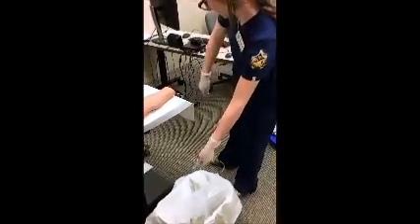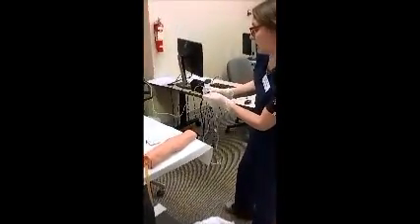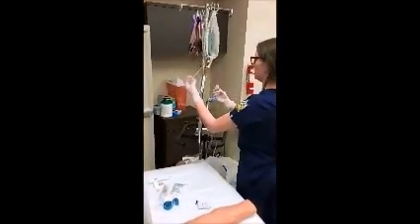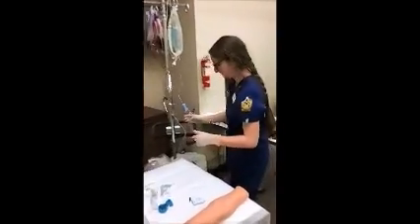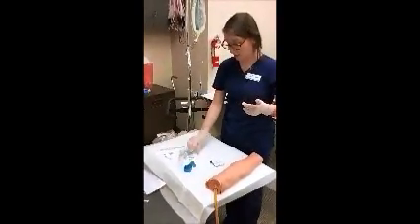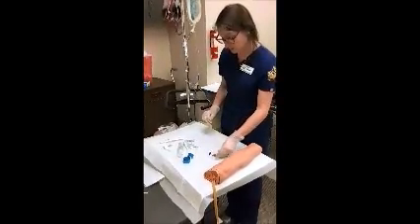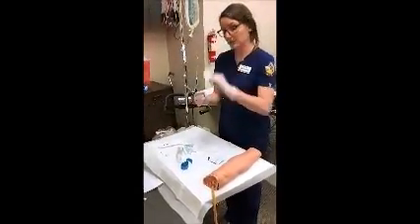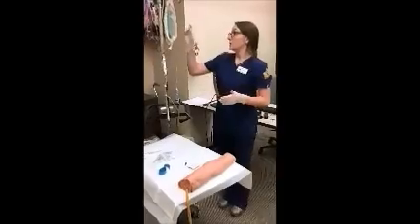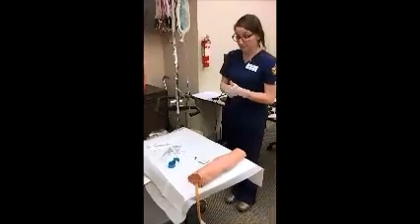You can see there's fluid dripping out of there. We will go ahead and close the roller clamp, and as a double safety, clamp that. Hang this up here and make sure to maintain sterility on that. We'll leave that cap on, that'll help remain sterile. And then we will gather the rest of our supplies: a flush, a catheter, an IV site Tegaderm, some alcohol swabs, tourniquet, and saline lock. And we'll go ahead and transfer all this to the room, including the IV pole. That'll ensure that no patient information is left out and that we have no other mistakes.